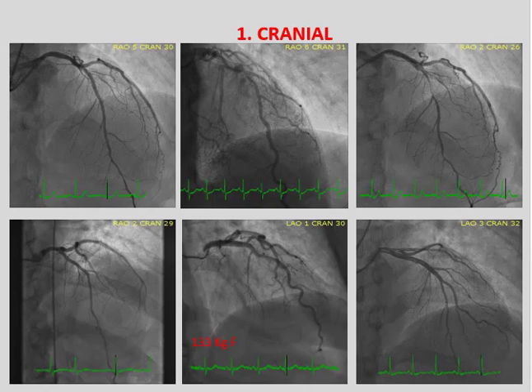This might clarify things. I will go through 3 of the major views for the left coronary artery for 6 different patients. This is the cranial view, which is to my mind the easiest because you don't have to memorize it. You can just look down at your chest, look towards your belly button, and then turn your head slightly. That is the cranial view. You can look at your heart. Strictly speaking, you're just looking down at your belly button, but your eyes have to focus on your heart.